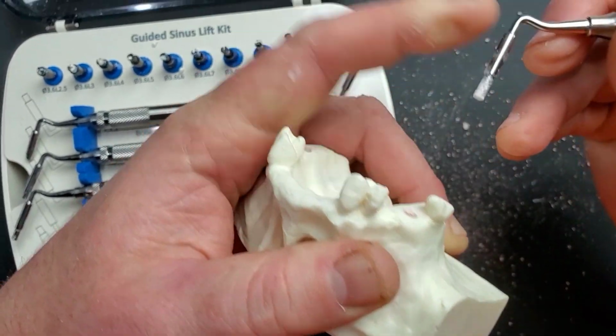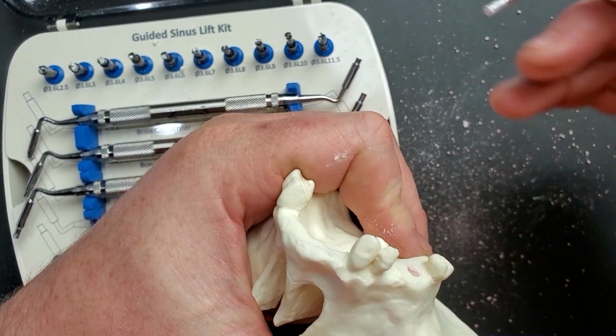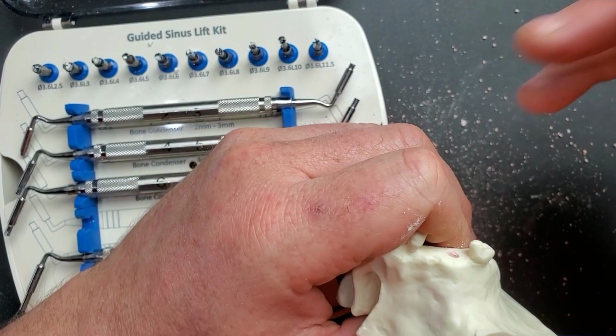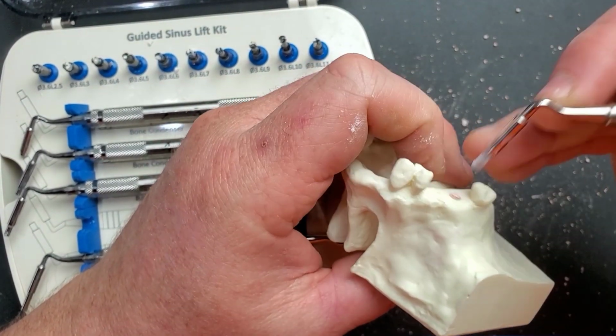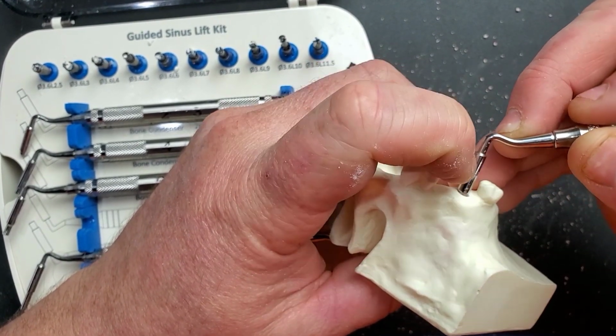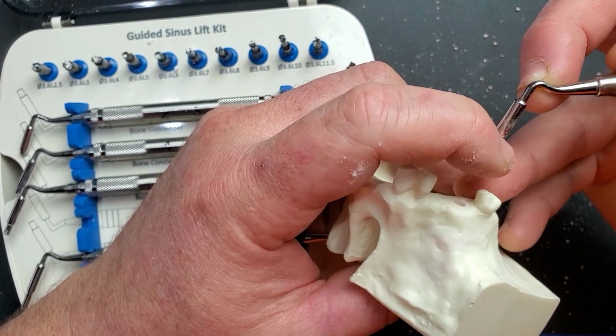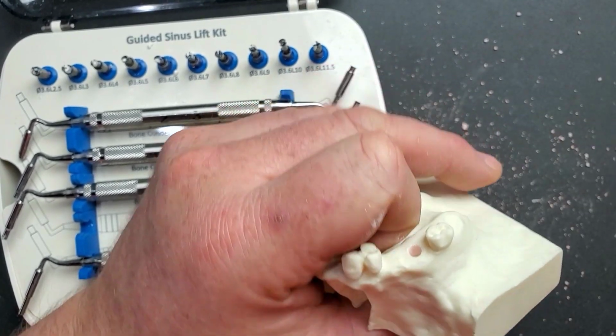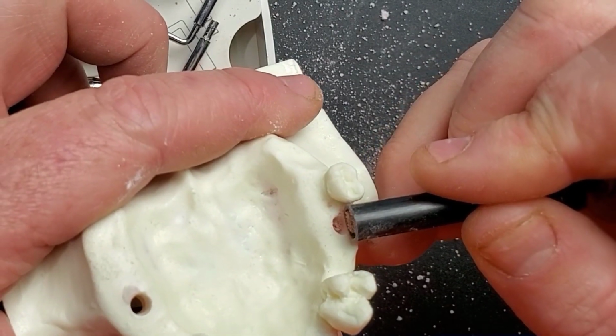And you can see now the stopper, obviously it doesn't work in the same way as the drills do, where the stopper is on the drill and that's bottoming out on the guide. Rather with this, the packer portion is designed to go internal to the hole, and then it's going to bottom out on the ledge that's right here on the carrier. That will just hit on the crest. One more load of bone and we'll place the implant.